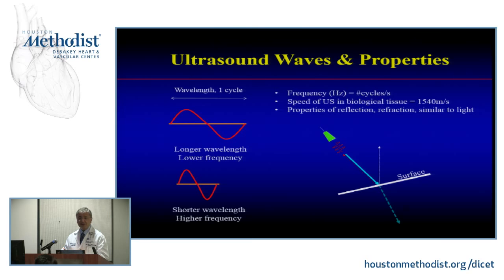Parasternal window is not your way to do it. A 4-chamber window is not the way to do it. For you to be able to see it, it's going to be either a subcostal, perpendicular to the atrial septum, or a low parasternal, a little more perpendicular to it. So these are some of the clinical applications, okay?